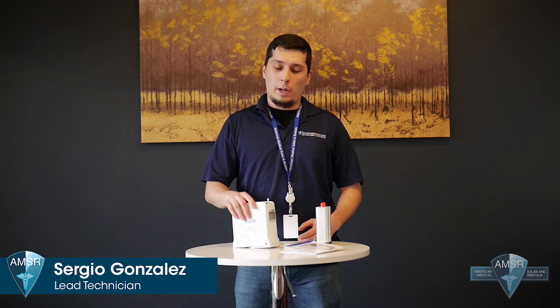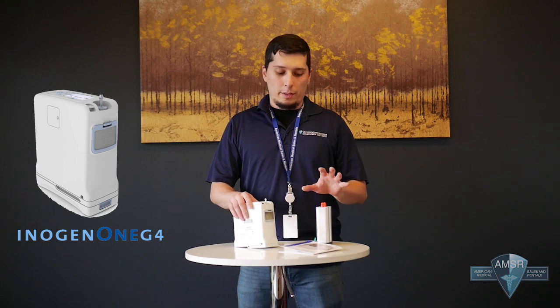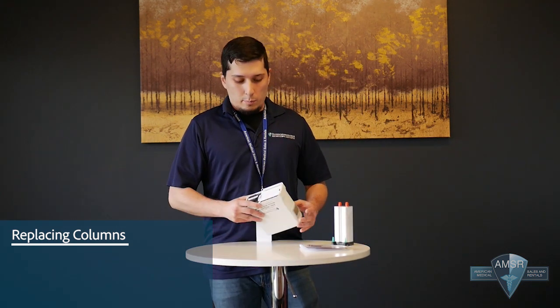This is Sergio, lead technician here at American Medical, going to demonstrate to you how to change columns on an Inogen G4. So they're a little bit different than the Inogen G3. These are actually a little bit simpler. What you'll need within the box is the instructional booklet and of course your columns. So in order to replace the columns on this particular machine, it's pretty straightforward.